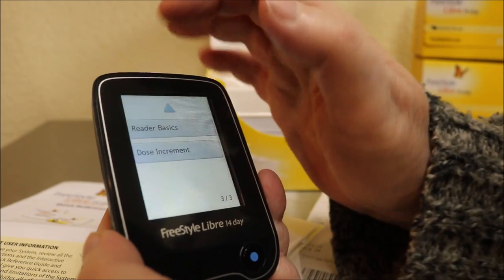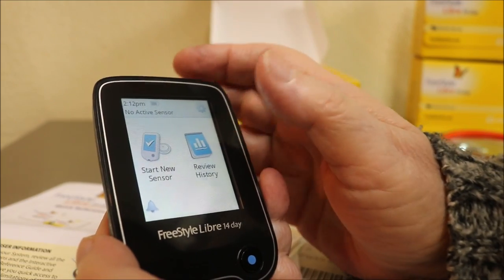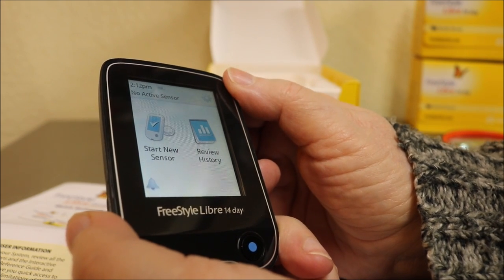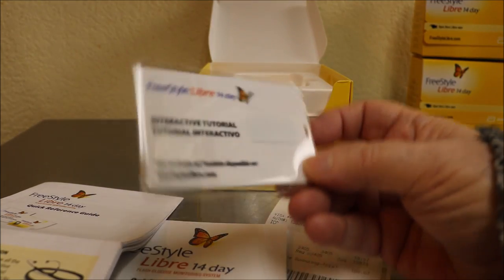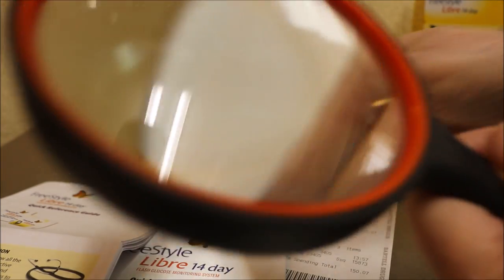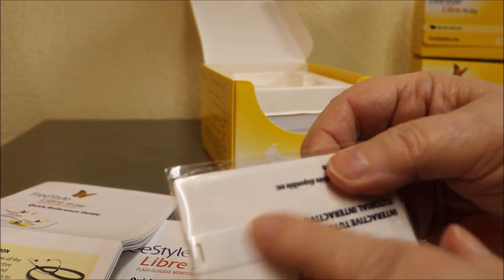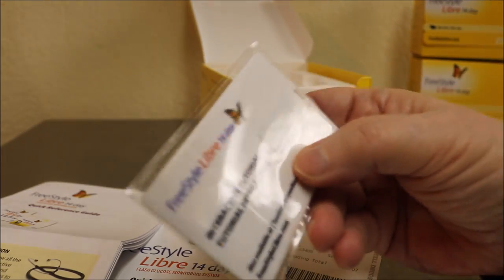Up in the corner it'll tell you how many days your sensor is good for — remember, they're only 14 days. Let me stop this section and start the one on the sensor. This is a USB reader — what it was that I couldn't identify. I'll put this little doohickey in my USB port and it'll be an interactive tutorial.